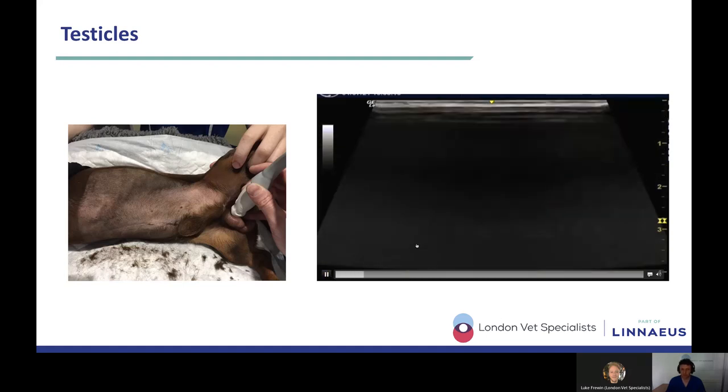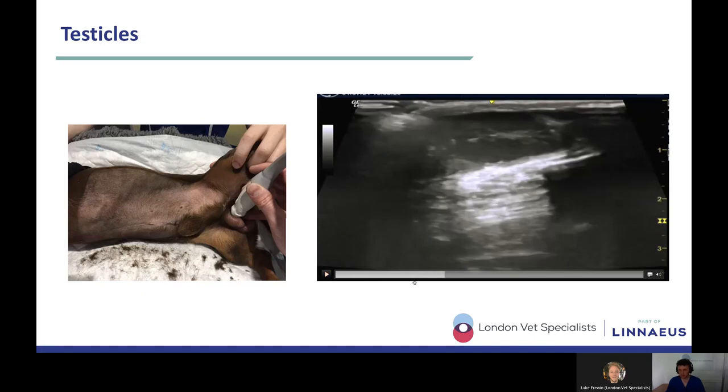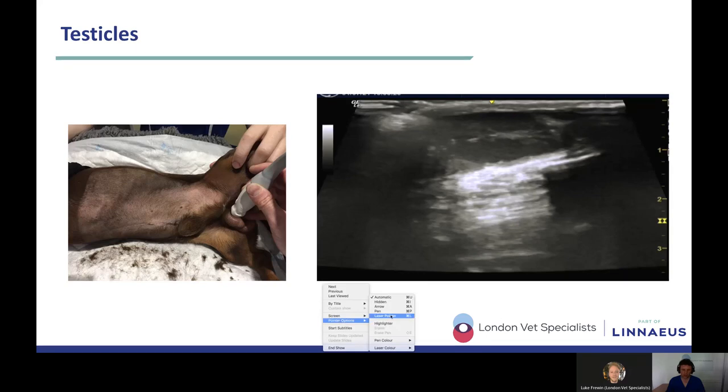So pop the probe on your patient, and here we can see that I'm going to need to change the position of my focal point. So I've gone from examining a deeper structure, probably the prostate, to examining a much more superficial structure. So my focal point's way down here. It should be up here, because this is where the structure that I'm interested in is. So this is our testicle. It's nice and normal.